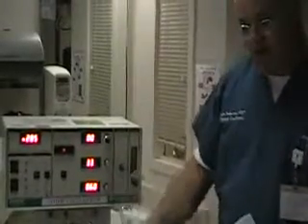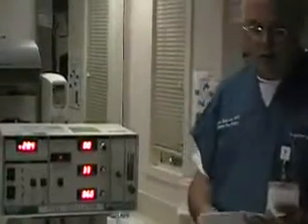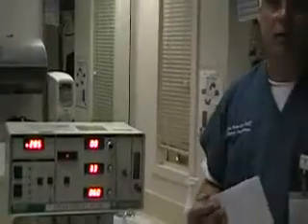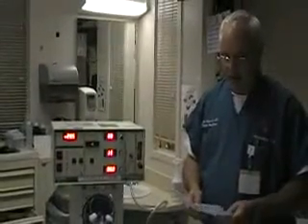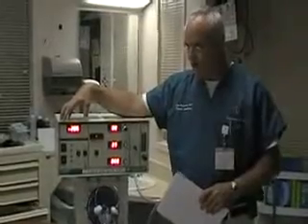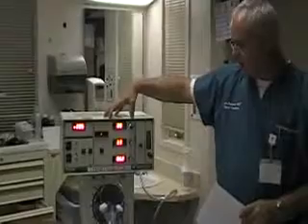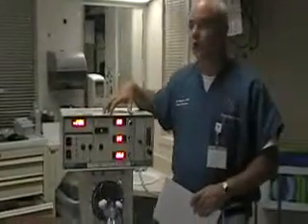After that, we're going to continue to reassess the patient, and we're going to normalize our lung volume, and we're going to want to see our chest x-ray. We're going to see lung expansion between 8 and 9 ribs, and we're going to make adjustments on our mean airway pressure for our oxygenation issues in increments of 3 to 5, and we're going to make changes in our amplitude in increments of 3 to 5 to control our CO2 or PaCO2 on our blood gas.